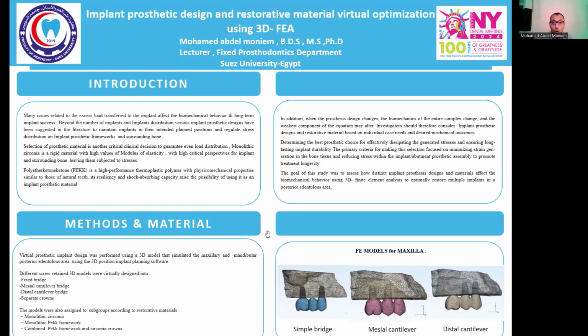The objective and the goal of this study was to assess how distinct implant prosthetic designs and materials would affect the biomechanical behavior, using 3D finite element analysis to optimally restore implants in the posterior edentulous area.